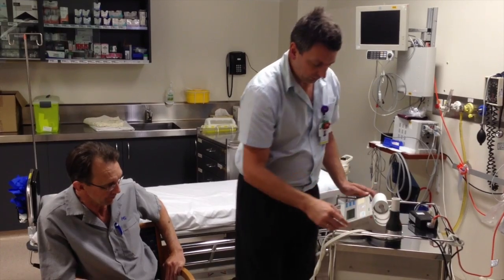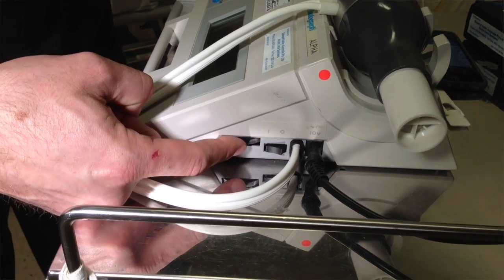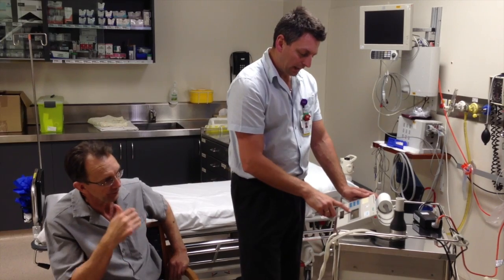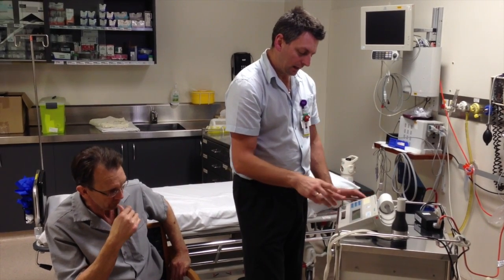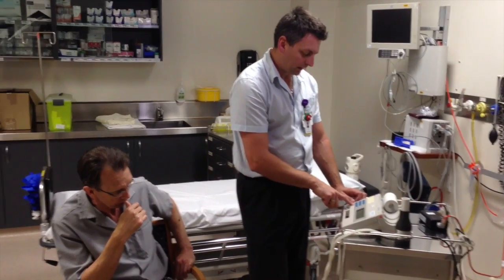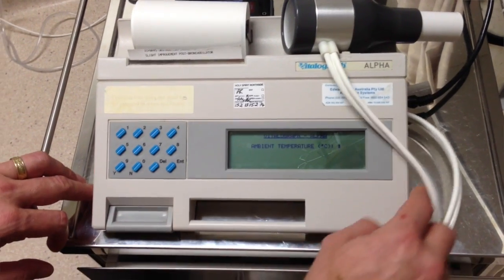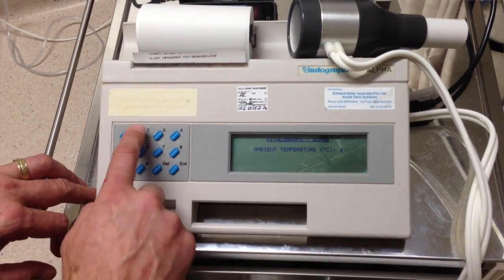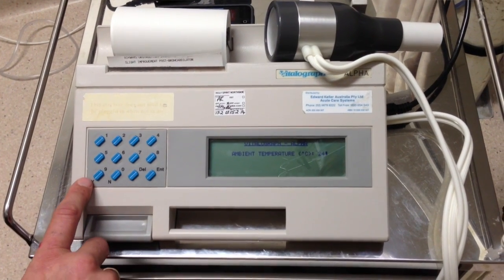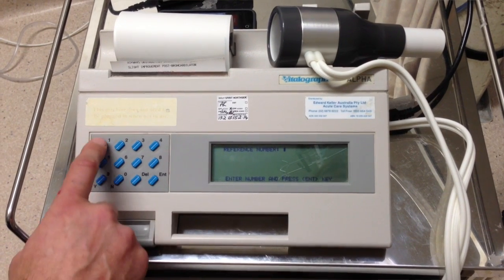To turn it on, down the right-hand side you'll have a turn-on button, and this toggle wheel just makes it brighter or less bright. It's got one of those old-fashioned screens on it. It comes up with a date and asks you to enter yes or no — there's a Y and N button. Press Y if you agree. It wants to know the ambient temperature, and then it will ask for a reference number. Usually you can put in the patient's date of birth as an identification.